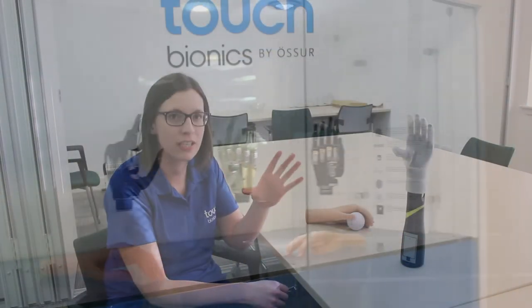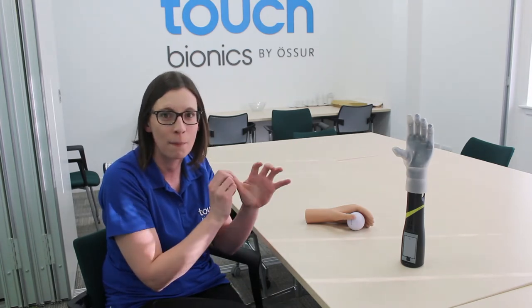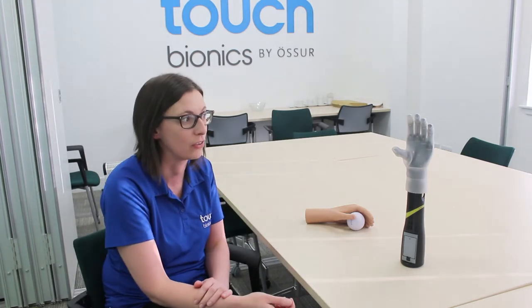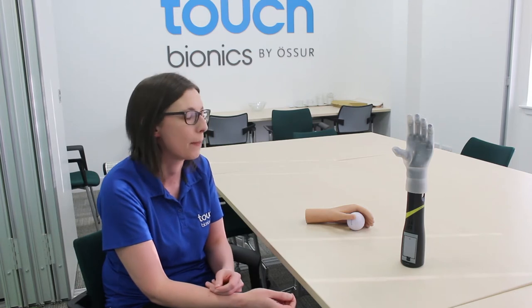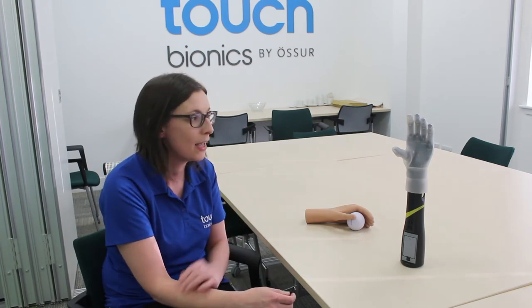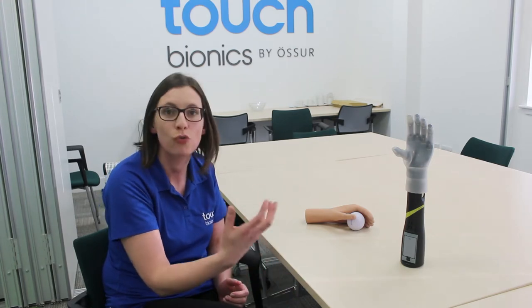Traditional myoelectric hands very much offered a single grip, which only gave patients one way to use their prosthesis. The i-limb hand, with a motor on each finger and rotation of the thumb, allows the hand to work in a much more natural way. For individuals using this type of prosthesis, it looks more natural but also functions more naturally. It can shape around objects so patients are not having to compensate as much in day-to-day activities — they can shape to their favourite mug for a cup of tea, or to what they need to dress their children.